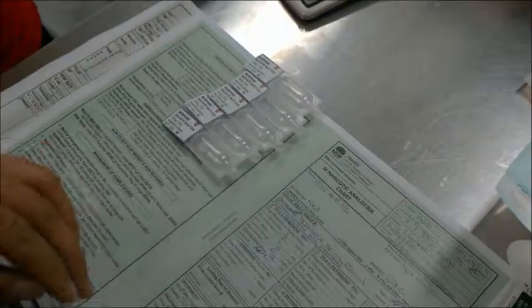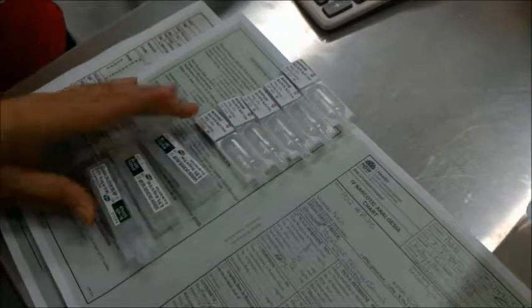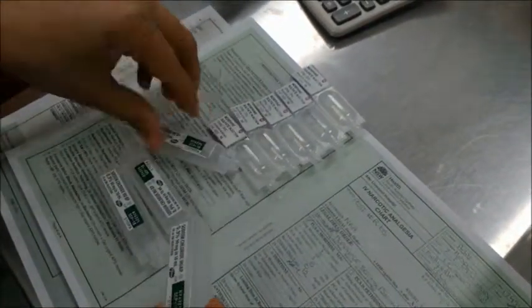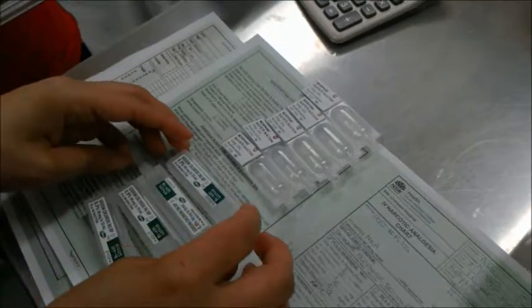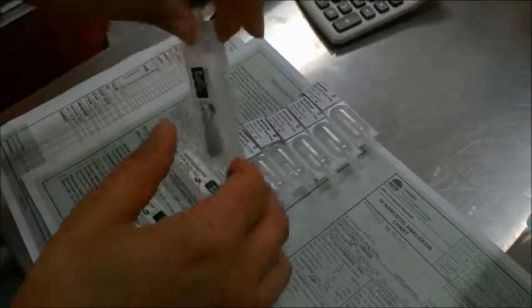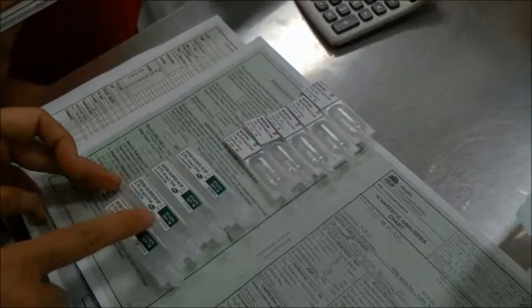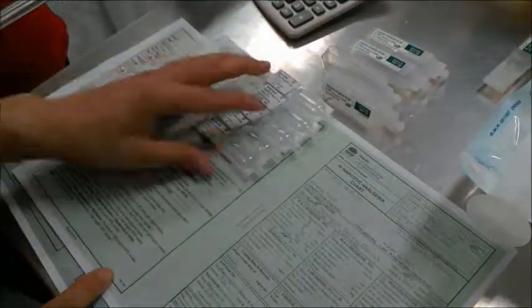Also, I have used normal saline, 4 of them. So they all are 0.9 normal saline. Expiry is September 18. 0.9 sodium chloride, expiry September 18. So they are within the date.